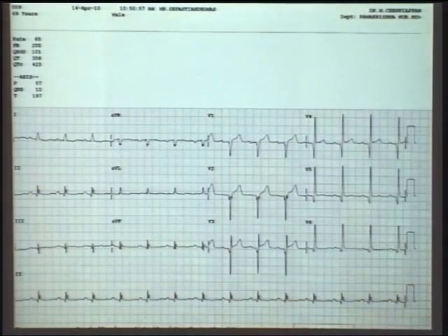So look at this ECG here. V1 to V2, I don't have any R wave, isn't it? So what I imagine is, below V2, I have totally dead myocardium. Whereas at V3, I have a deep Q and a small R. So below V3, what do I have? More of infarct area, less of healthy myocardium. Whereas see V4, my R wave is big and the Q wave has become smaller. So below V4, I have more of healthy myocardium, less of infarct myocardium. So total QS, deep Q wave and small R wave, small Q wave and big R wave.